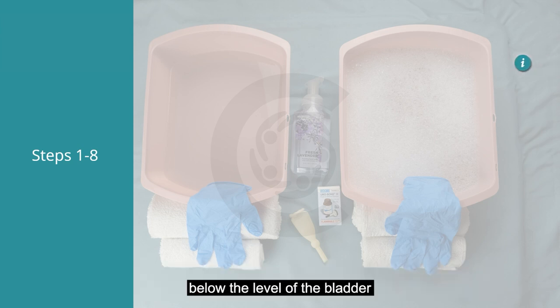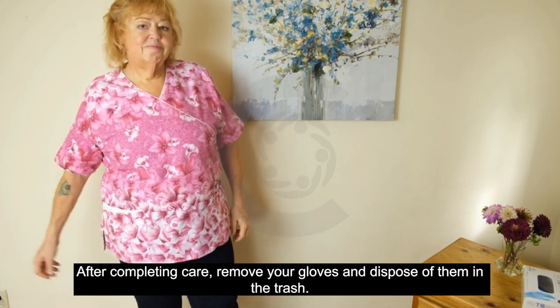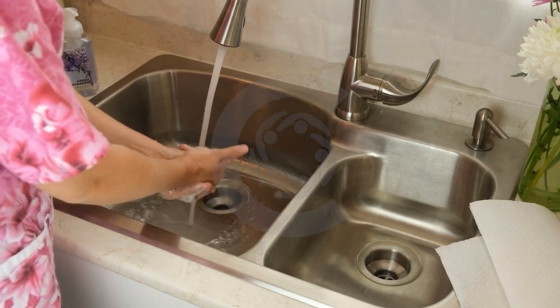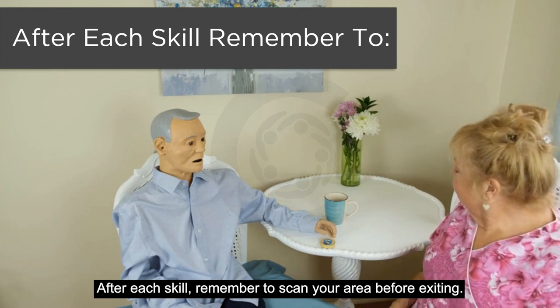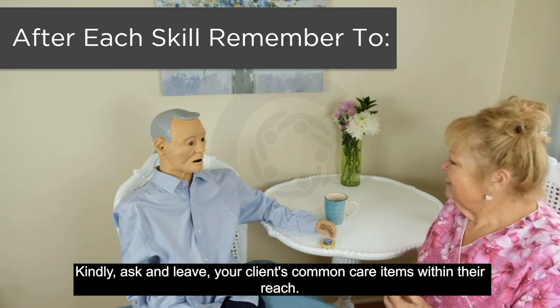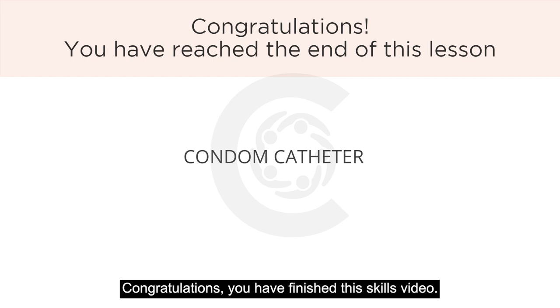Secure the tube to your client's leg using a catheter strap, and ensure the bag is below the level of the bladder. After completing care, remove your gloves and dispose of them in the trash, then wash your hands. After each skill, remember to scan your area before exiting and leave your client's common care items within their reach. Congratulations, you have finished this skills video.